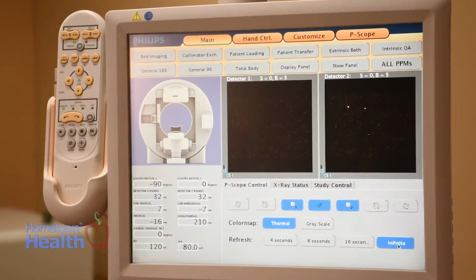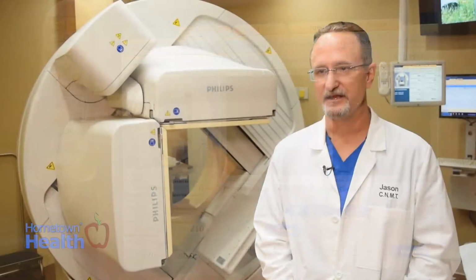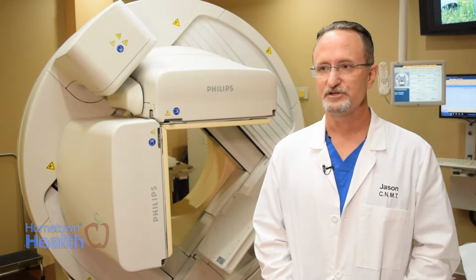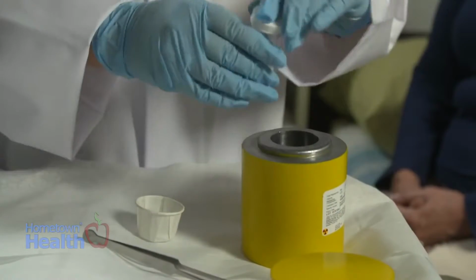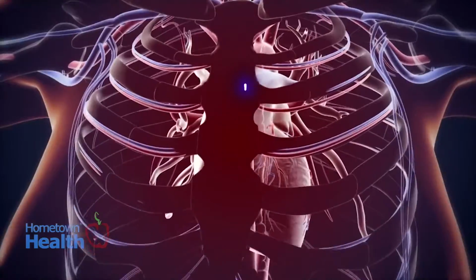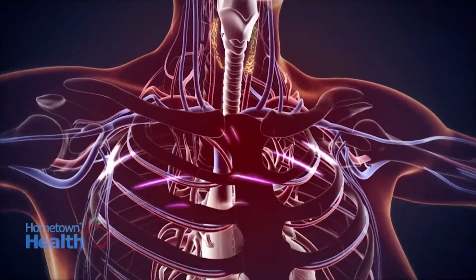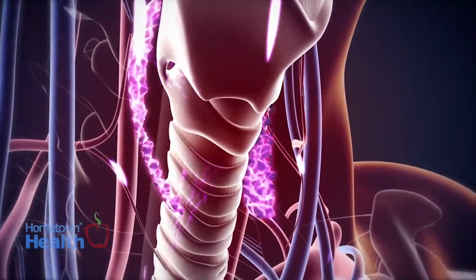With a nuclear medicine thyroid uptake scan, there's definitely a patient prep list that you have to follow, and that's something that we explain to each patient as they come in. But generally speaking, you would come in the first day of your test, you would take a capsule. The capsule that we give you is basically radioactive iodine, so it's like radioactive table salt, for lack of a better explanation. Your thyroid takes up the iodine, and then we image it 6 hours later.